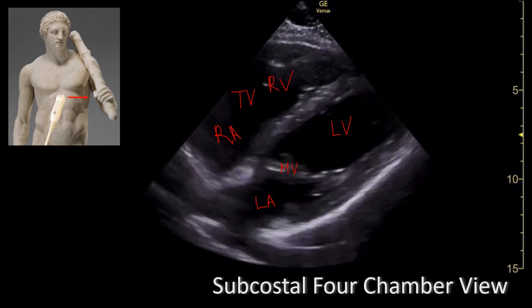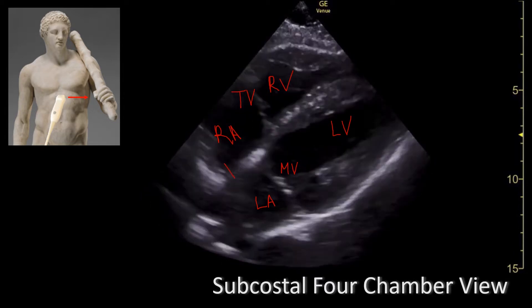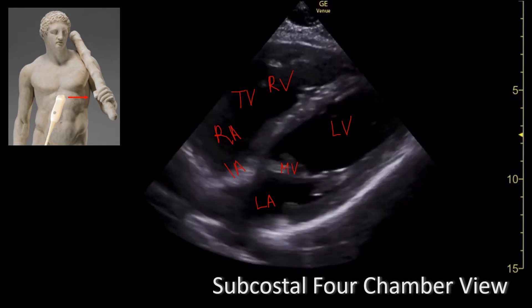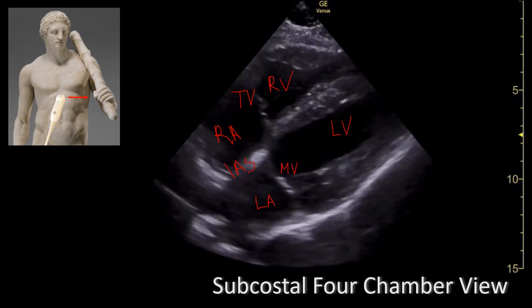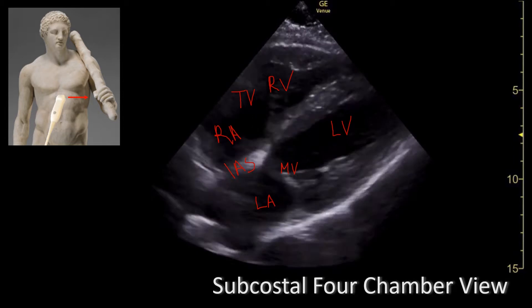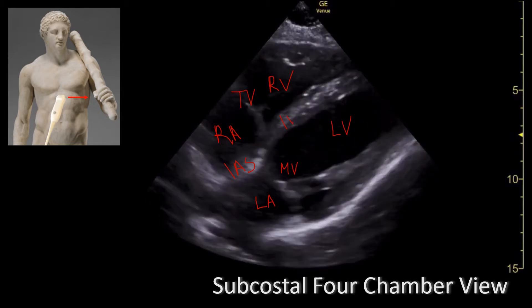Between the right atrium and the left atrium, you have the interatrial septum. And between the right ventricle and the left ventricle, you have the interventricular septum.